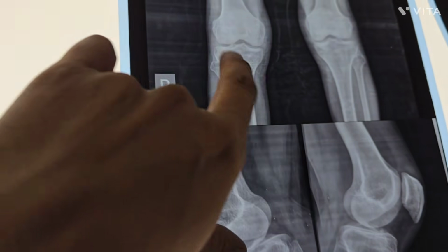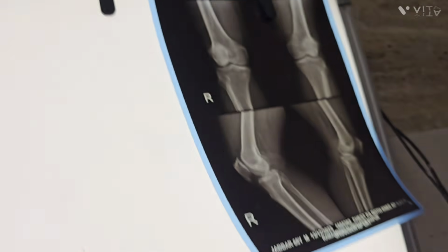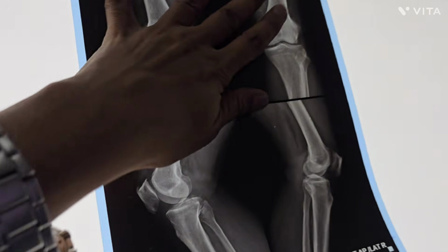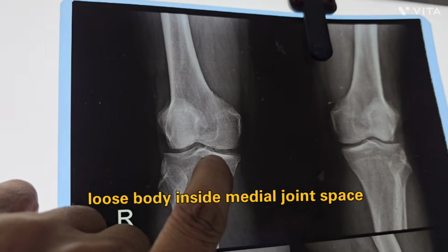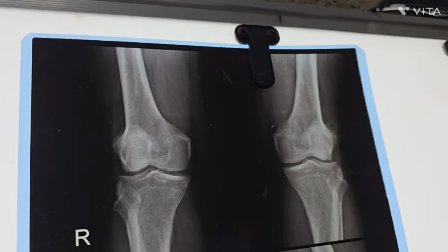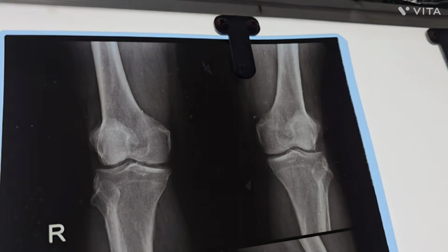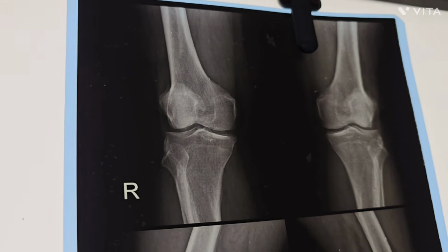There is no abnormality, so this X-ray is normal. Now the third one: you can also see some kind of loose body inside the medial compartment, but the joint space is normal. So it may be due to meniscal hypertrophy or some kind of loose body inside the knee joint.